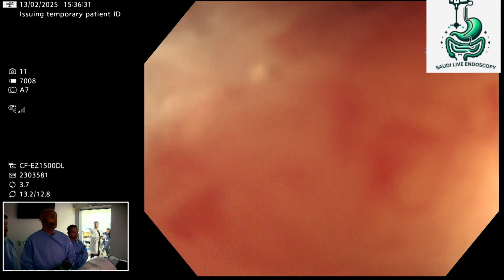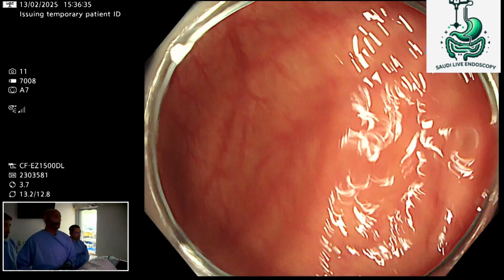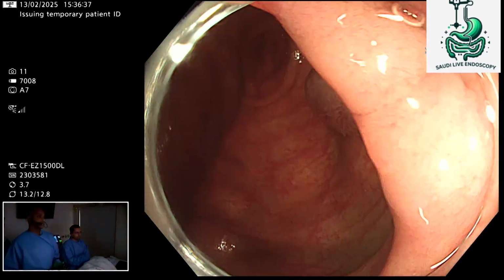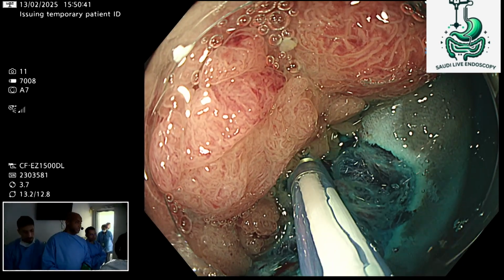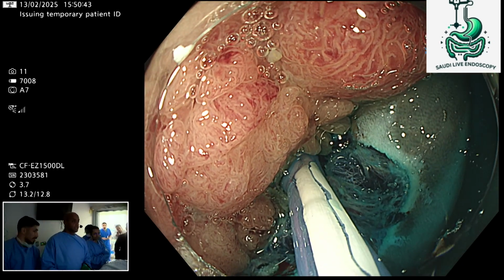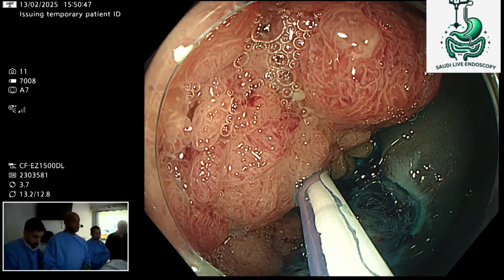So the endoscopy picture is just buffering a bit. I'm not sure if someone from audiovisual there can fix it. We're having the same issue here, I think, even for us. Hello, do you hear us? Yes, Dr. Ammar, we can hear you. Yes. How's the progress?